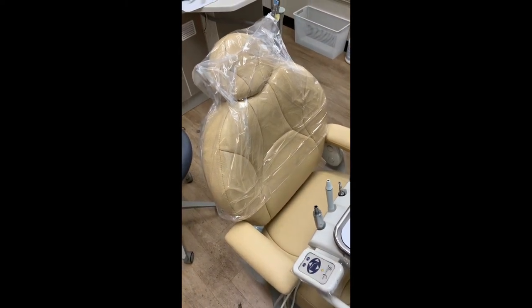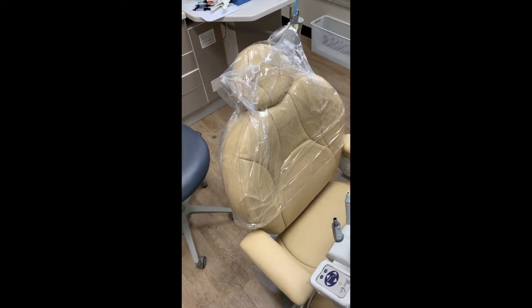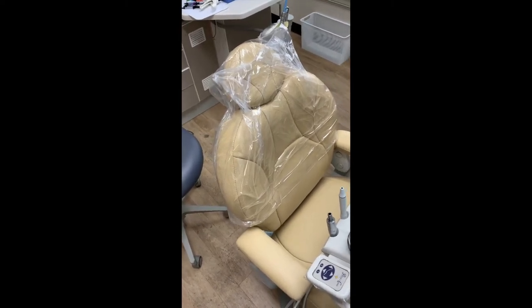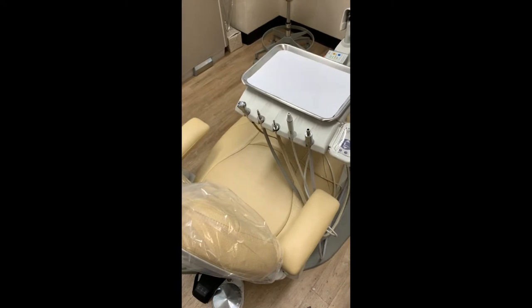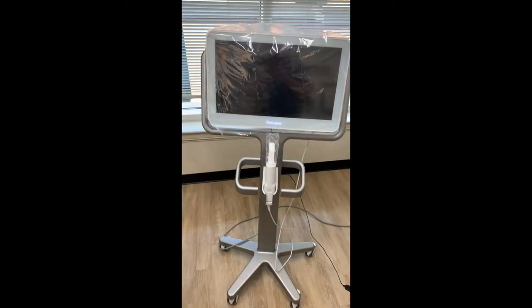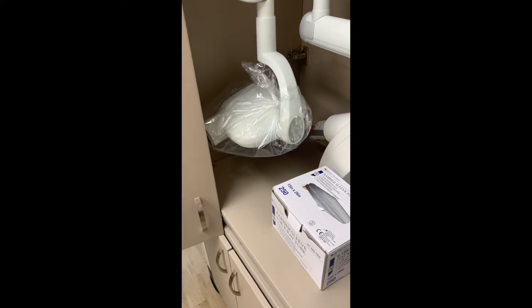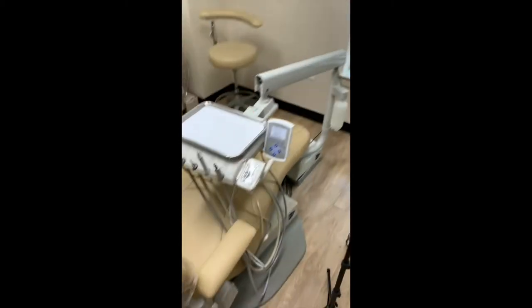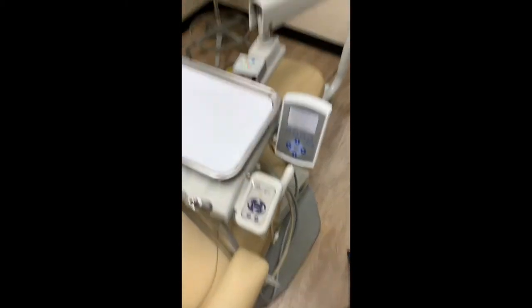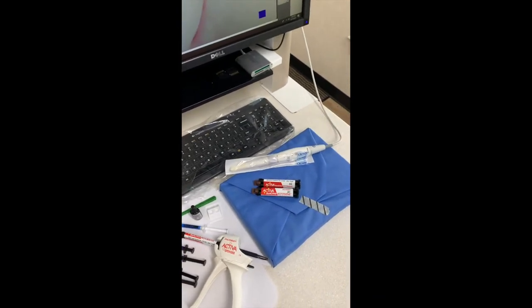Our dental chairs have plastic coverings, which we've always had, in addition to wiping down between each patient. We have covers that we place on the hoses between each procedure. We cover our iTero and we also cover our x-ray tubes and cover any touchable pad surfaces and our intraoral camera.